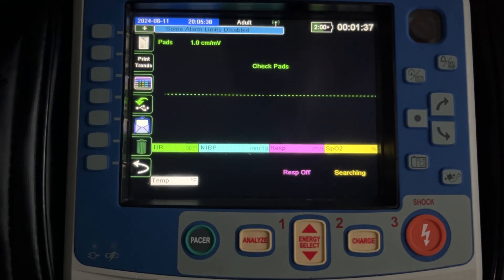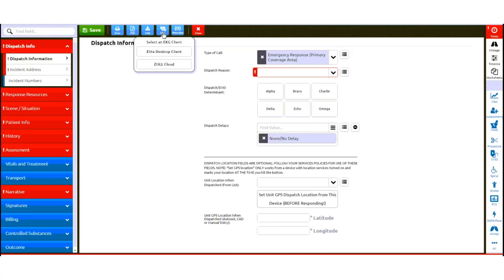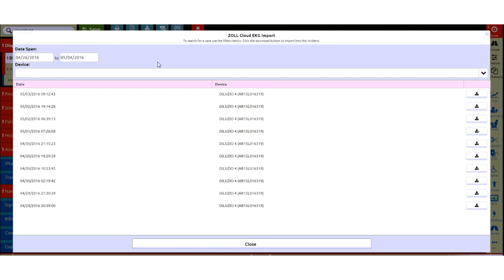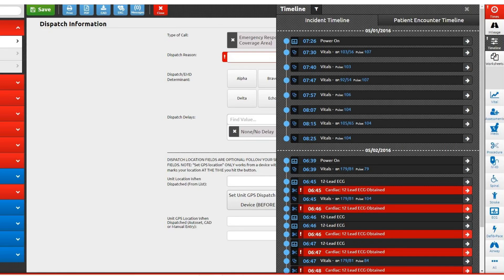We'll take a look at what to do on the ImageTrend side now as well. If you're using the ImageTrend Elite program for your patient care reporting, once you open a new patient care report, across the top you'll see EKG and then select Zoll Cloud. There will be a message that appears saying 'Getting Case from Cloud.' The available case files will then be listed by the date and time the call occurred and the device that was used to run the call. Select which call you'd like and then click the download icon on the far right-hand side. You'll then see a list of all of the information that was uploaded from the X-Series, which will help you complete your report.